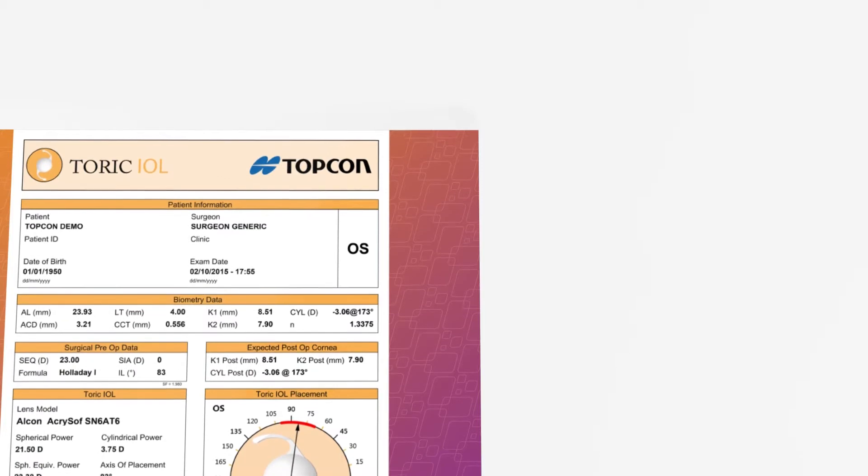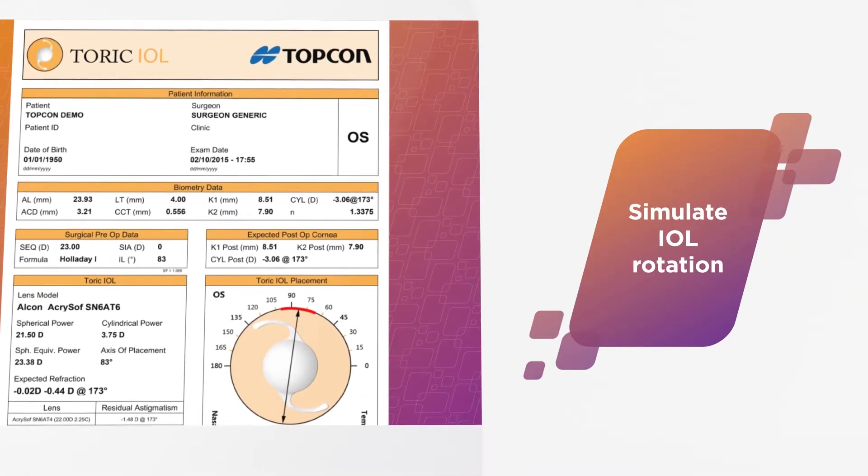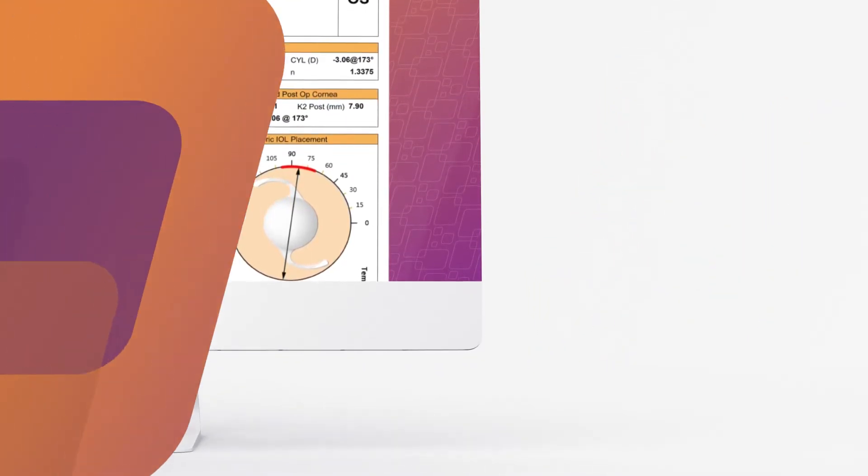Aladdin also features a powerful program that simulates IOL rotation to optimize surgical outcomes and aid in planning revision surgeries. My name is Ricardo Almiron and I am the product manager for the Aladdin Biometer with Corneal Topography. Today we are going to see the proper way of taking a measurement with the Aladdin Biometer.